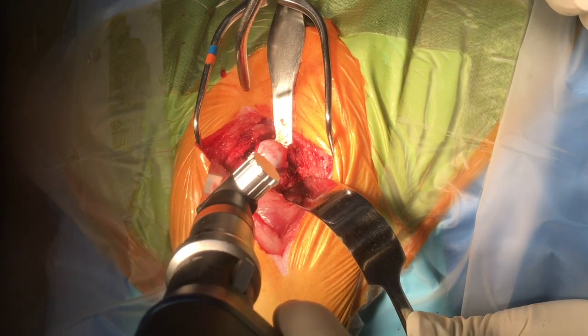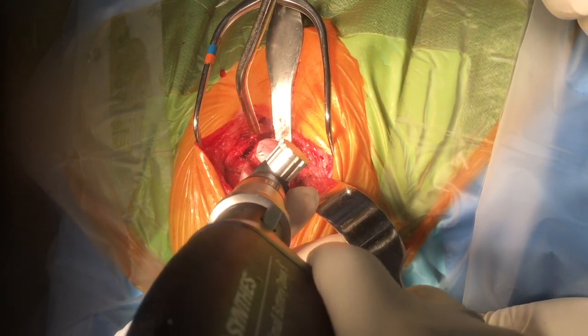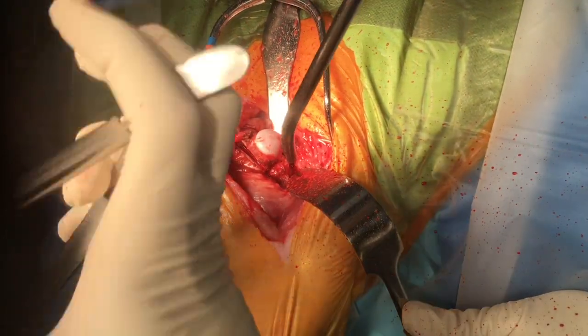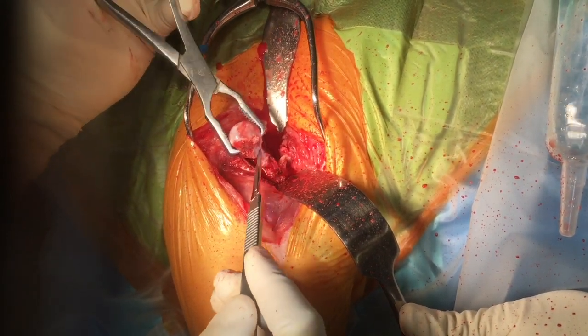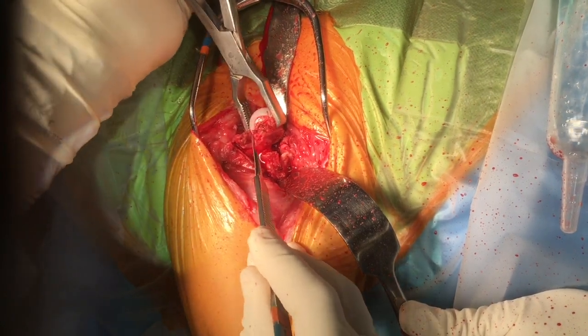The osteotomy is made with a sagittal saw, with a blunt instrument under the joint capsule. Care must be taken to angulate the saw in the appropriate plane. The femoral head and neck are then detached from the rest of the joint capsule by sharp dissection.